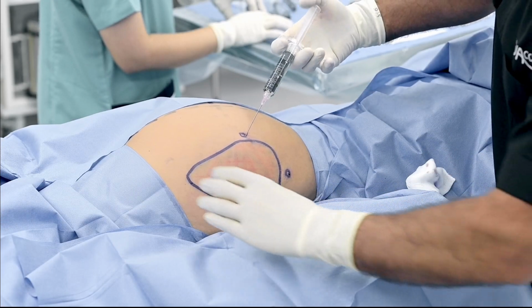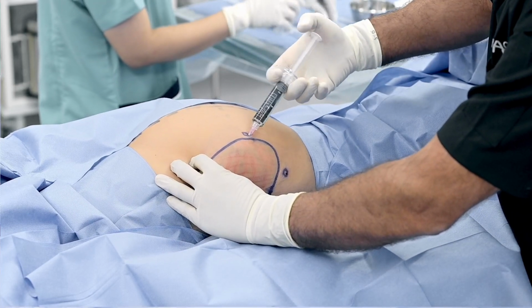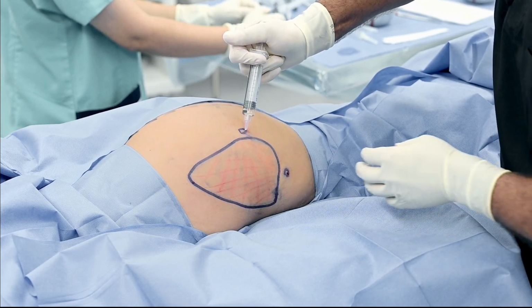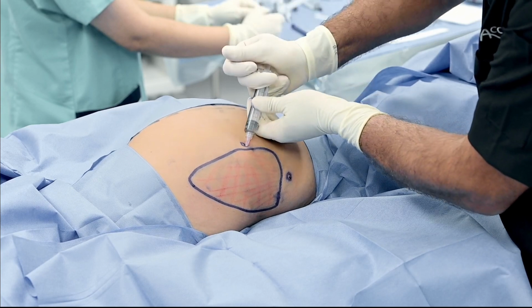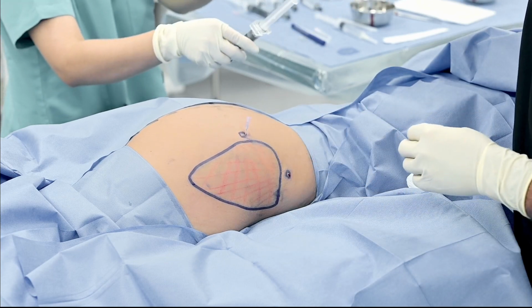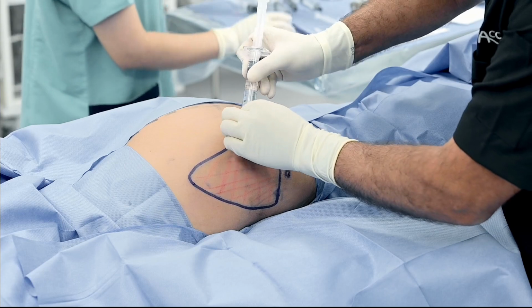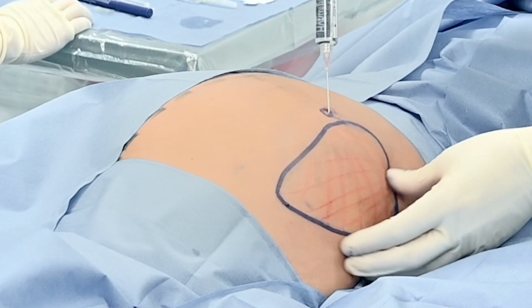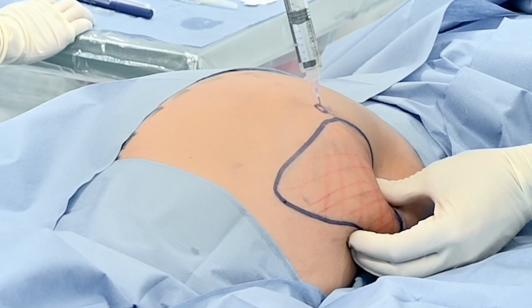The injection of HYAcorp MLF2. It's very important to pinch strongly because, as you know, in the hip dips, we have less capacity of expansion because the superficial fascia is stuck to the deep fascia. So, good pinch and deep injection.